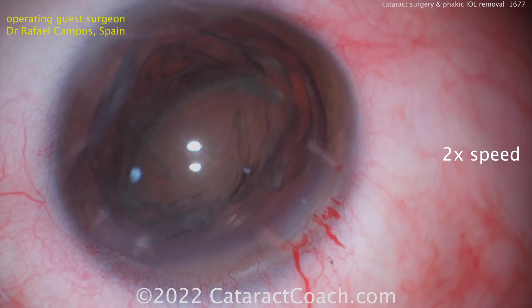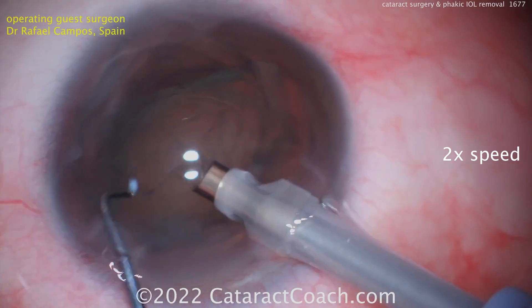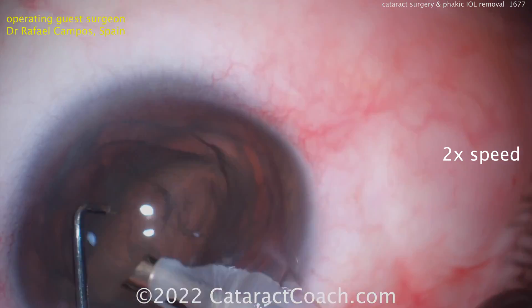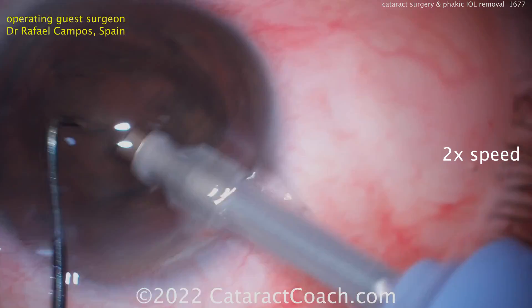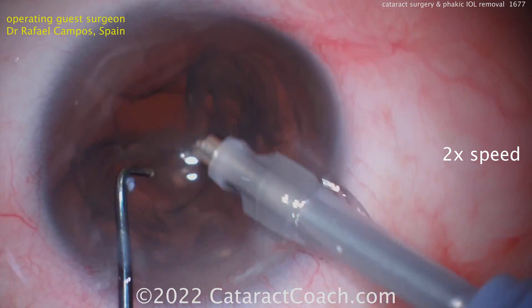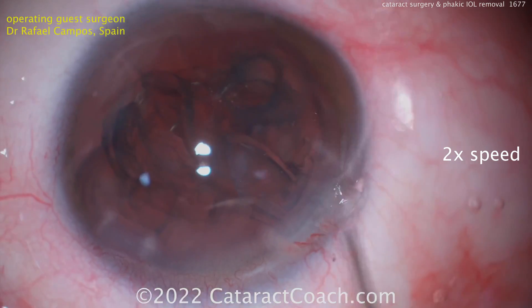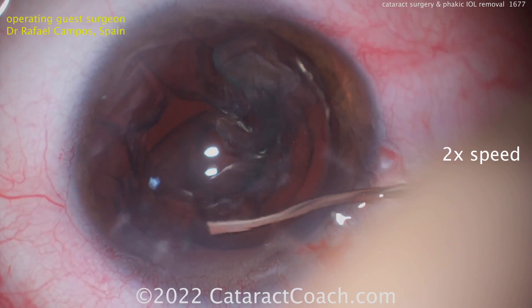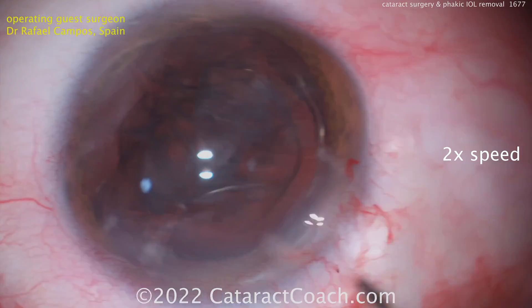For a patient who's this myopic, if you're putting a monofocal lens in, aim for some degree of myopia. If the patient wants great distance vision, maybe aim for minus 0.5. If the patient wants more functional reading or intermediate vision, aim for more like minus 2. The patient had some denser central endonucleus, but the rest of the epinucleus shell is pretty soft — you can get that out with BSS on a cannula and just wash it out, or use the IA probe.